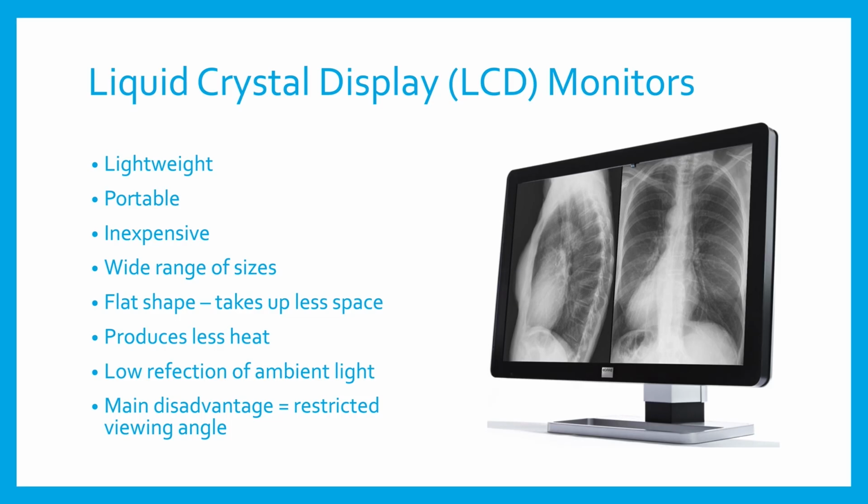So the first thing we're going to talk about is a liquid crystal display, otherwise known as an LCD monitor. And this is basically the monitor type that we use in radiology. So with the advantages, it's lightweight, it's portable, fairly inexpensive, a wide range of sizes. Obviously its flat shape takes up less space. It doesn't really produce any heat, and there is little reflection of light from the room.